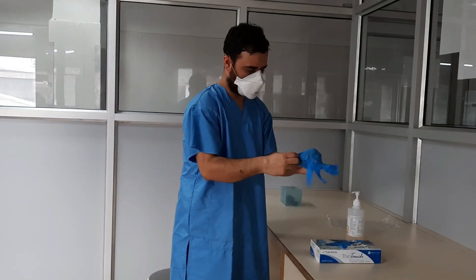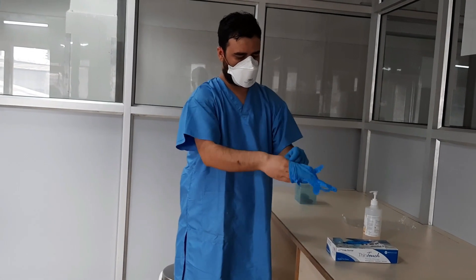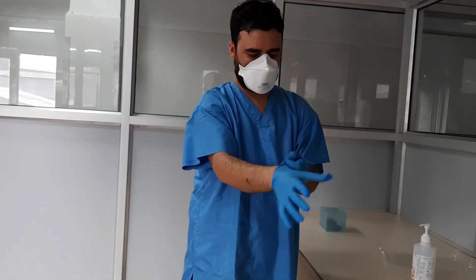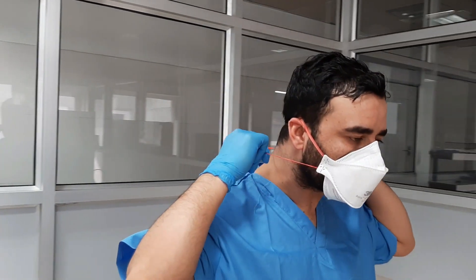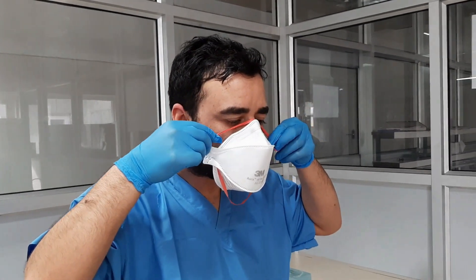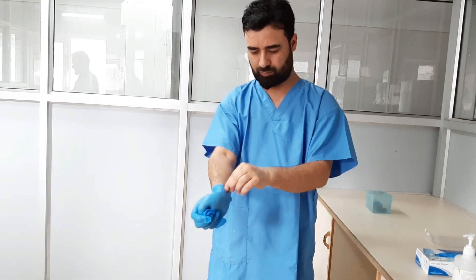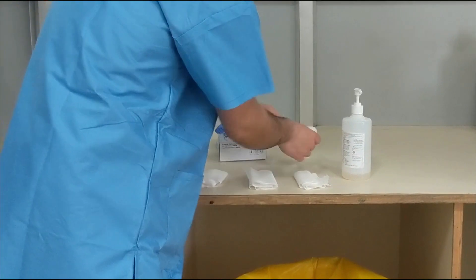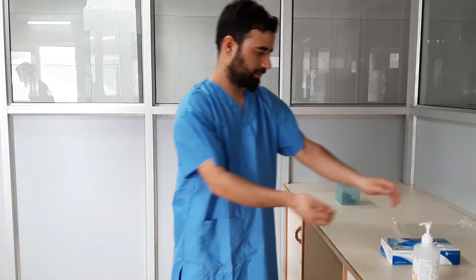Wear a fresh pair of gloves before removing the N95 respirator. Remove your N95 respirator and discard gloves appropriately in the color-coded bin. Perform hand hygiene.